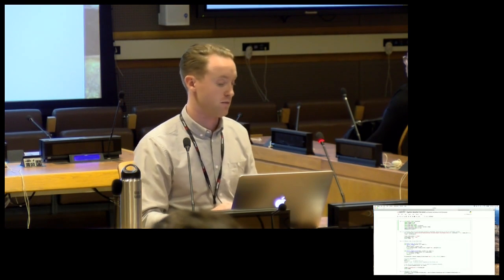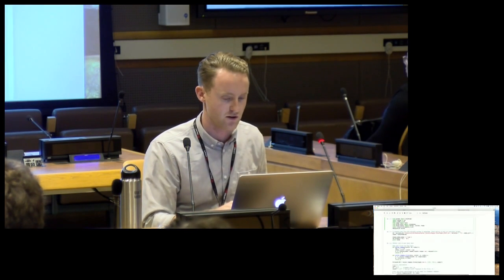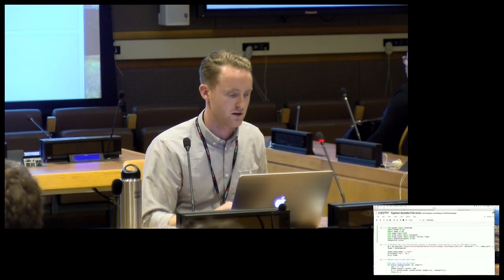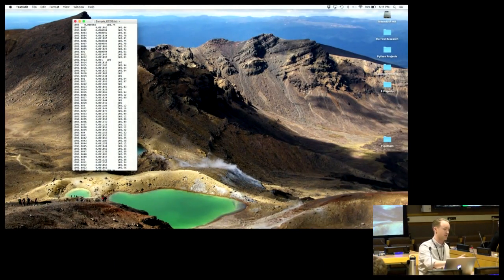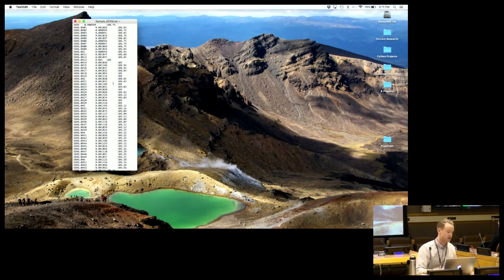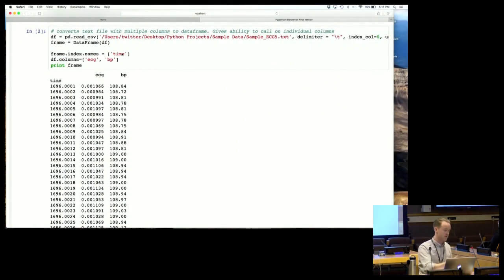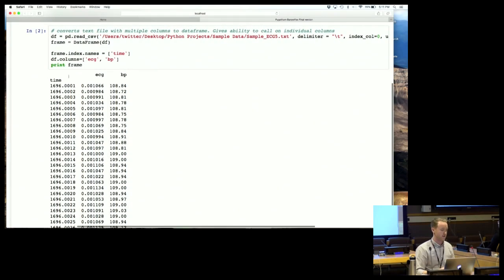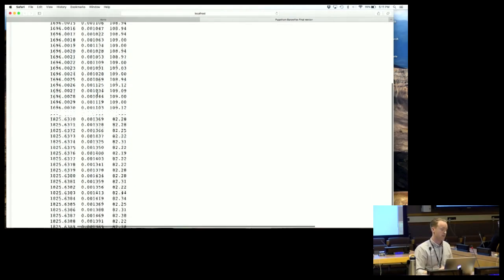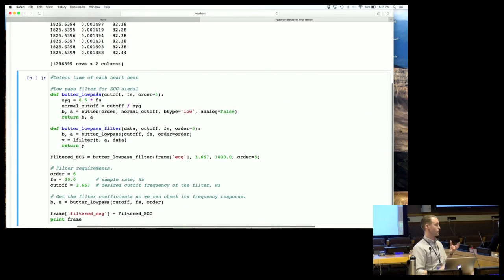One of the big things for me was pandas and specifically DataFrames, because I'm working on so many channels of data it's easy to take all that and quickly relate different channels to one another and easily aggregate multiple channels at the same time. This first part is just importing a text file as a DataFrame - this is the text file output from the LabChart program with three channels: time in seconds, the ECG, and blood pressure traces. You can easily import that into a DataFrame and specify column labels and the index.